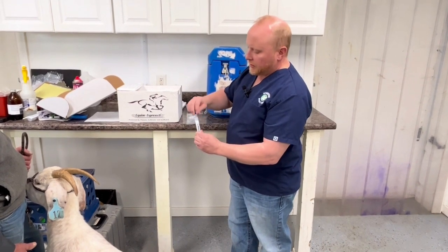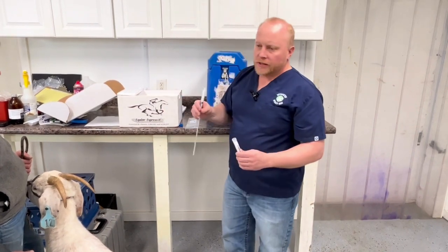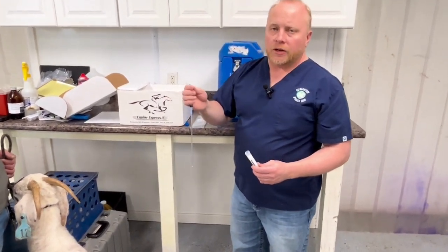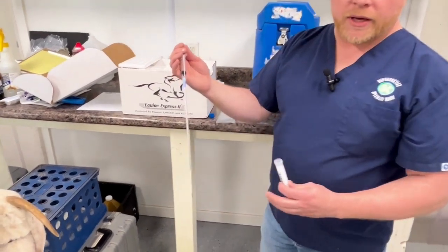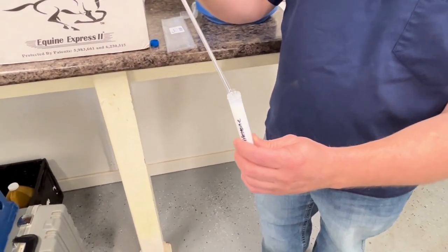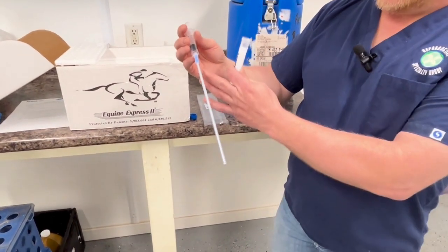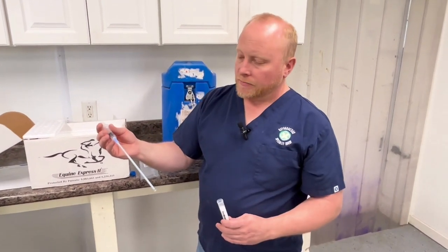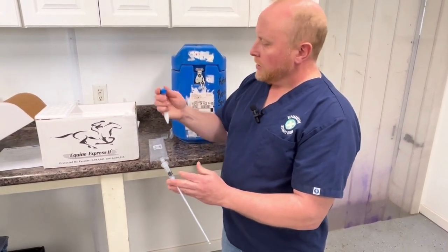We know there's about 13 mils of semen here. Per the instruction sheets and the concentration of your sample, one mil of semen is going to equate to about a hundred million sperm cells per breeding dose. We're going to start with about one milliliter of air in the syringe to make sure we get all of the semen dispensed from the pipette. Then we stick this just inside the vial and draw up one mil of semen. In this nine-inch pipette that is effectively the full length of the pipette, so you don't have to get the semen up into your syringe. Keep that tip nice and clean, then recap the sample and put it back in the cooler.